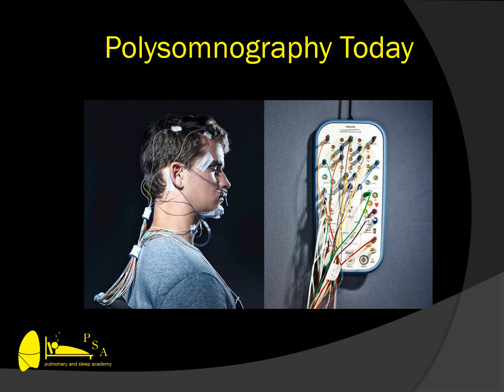So moving on to a more modern rendition of a sleep study, you'll see on the right is what is known as the head box, and this basically, along with a laptop or a desktop, will completely replace the entire GRASS machine and the 3 phone books of paper that we used to use in recording a sleep study. The patient here, having been hooked up with all the parameters we talked about before, can simply unplug the wires from the top of this head box and go to the bathroom or take a break. That question often comes up with patients: how do you deal with all those wires?